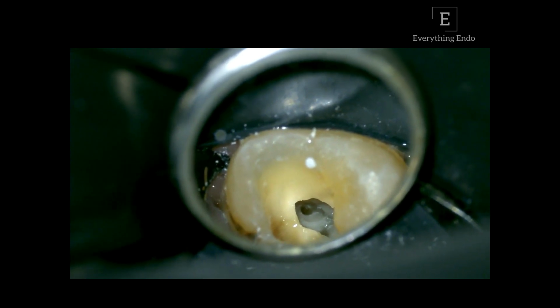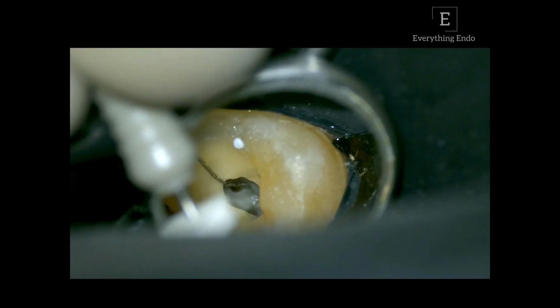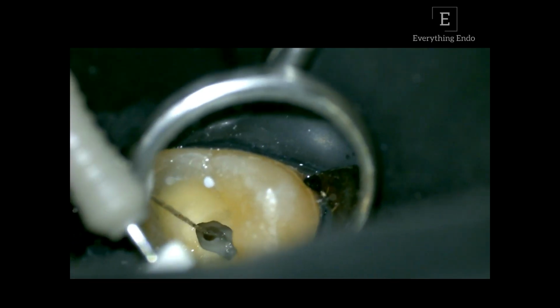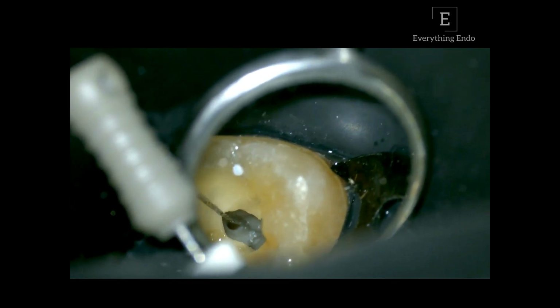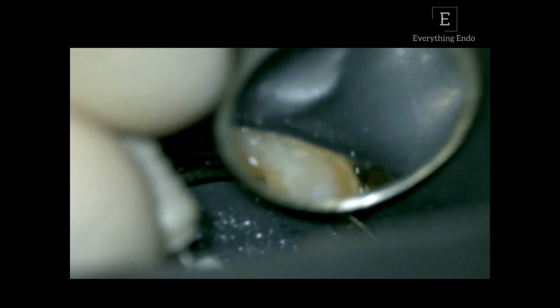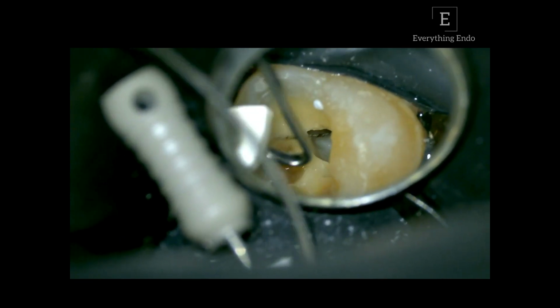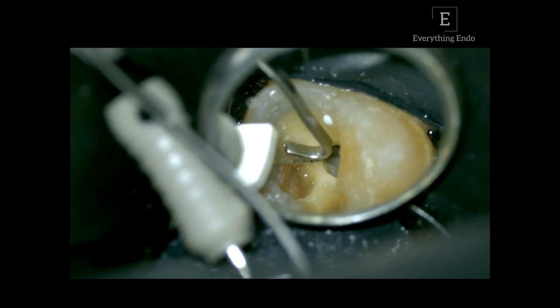So that's a small groove there where I hope to find my MB2 canal. I've introduced my D finder into that area. And now, as you can see, I am moving the hand file distally and then using a watch winding motion until I have managed to negotiate a few millimeters. Now I would go in with a rotary file, open up the orifice further, and then go ahead with my process.